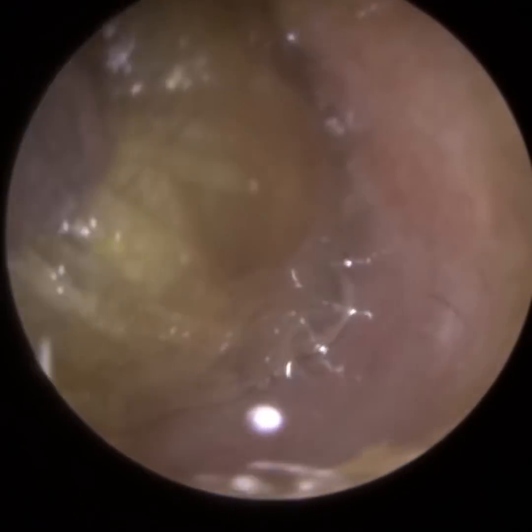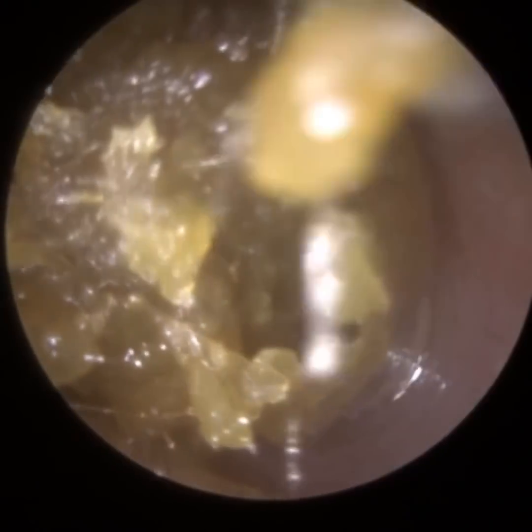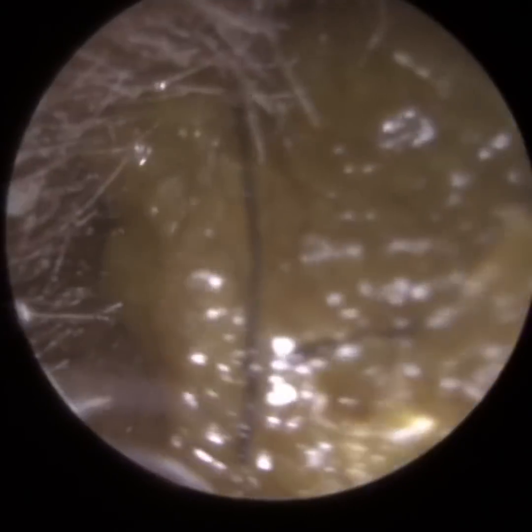So I'm just wriggling this plug of wax. I've put some oil in there, just to lubricate it and bind this wax together to get a better suction grip. You can see this plug, although it's soft to the core, is enveloped by a layer of dead skin, keratin. We're just wriggling this out slowly but surely. You can see that immaculate view we have in an endoscope. You can see the whole ear canal in one shot.